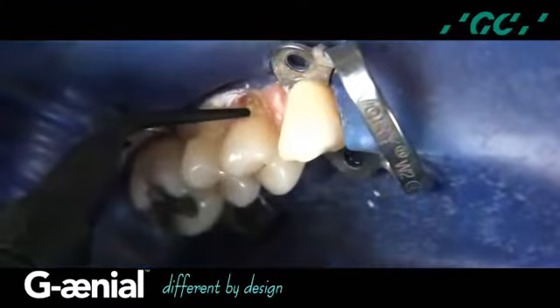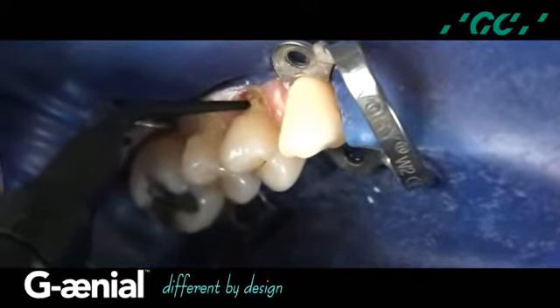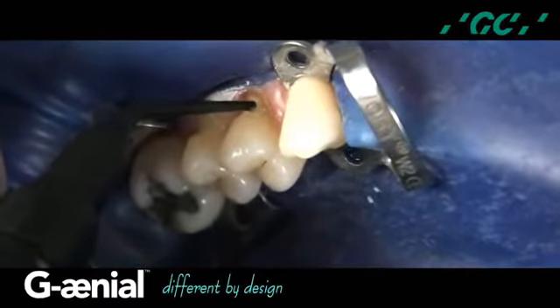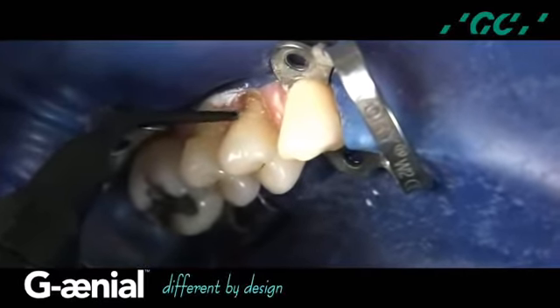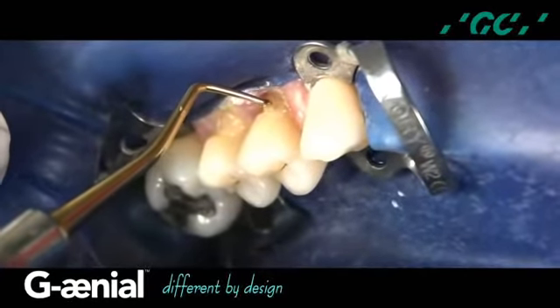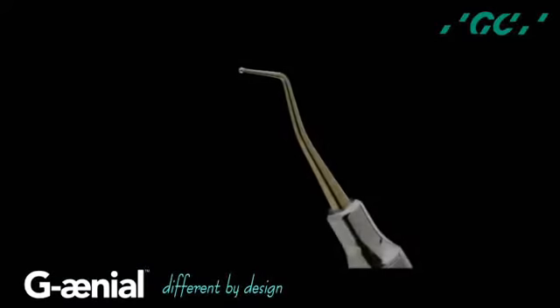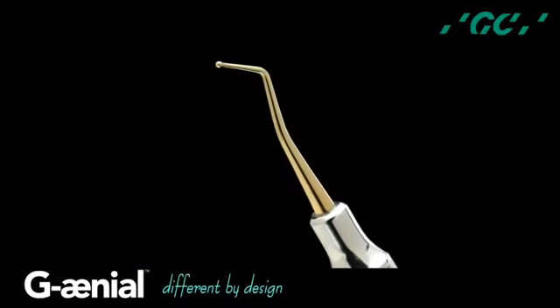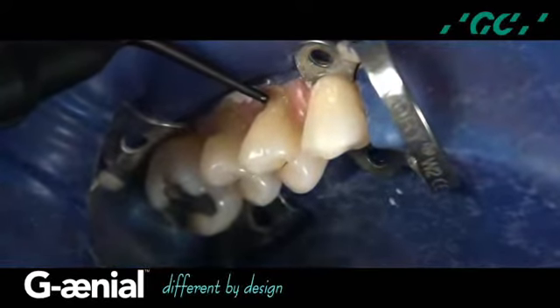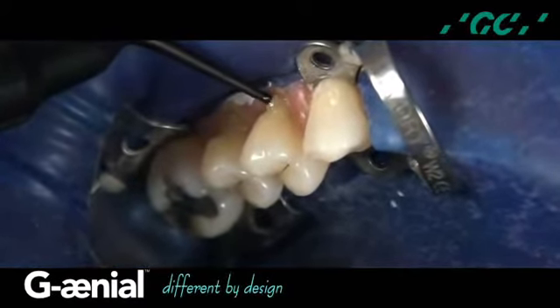The initial layer of A1 shaded Gineo Universal Flow is applied to the axial wall of the preparations with a syringe tip and uniformly distributed and adapted with a round tipped instrument, an M1 by American Eagle, and light cured for 10 seconds. A second layer of A1 shaded flowable is applied with a syringe tip.